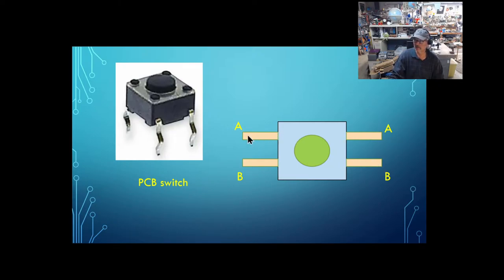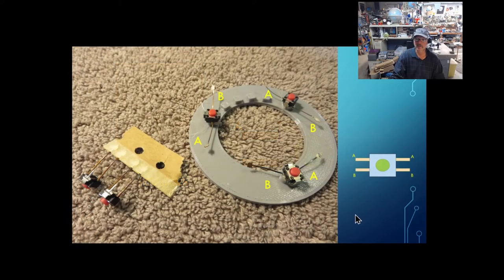When you bend them out straight, you're going to realize that this particular strip looks like it goes all the way through, because it does. And it's how you hook these wires up. When you're working with a normally open switch, if you push the button, all it does is connect one wire to the other wire. In this case, you're going to connect the A side to the B side every time the button is pushed. It's as simple as that.